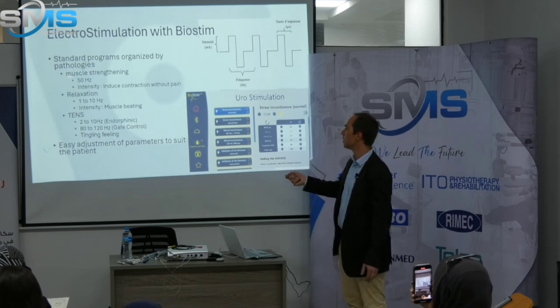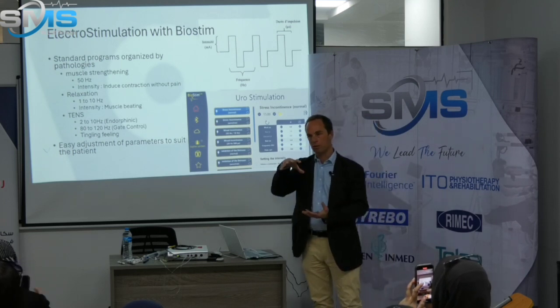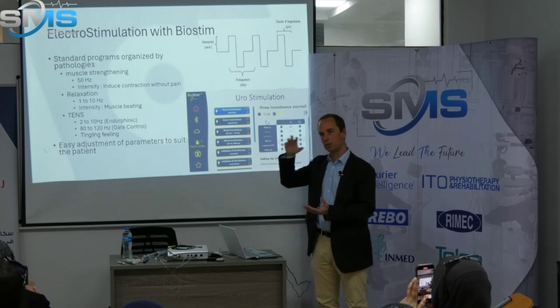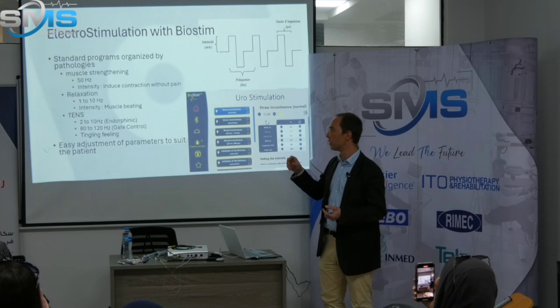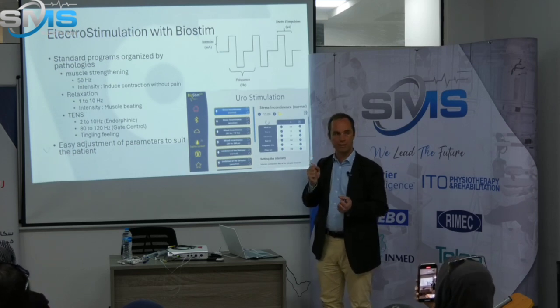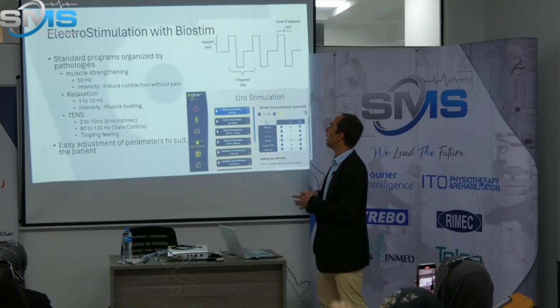That's why we are using it a lot. The second one is relaxation. This can be used for bladder overactivity. With this current, you can relax the bladder. It can also be used for overactive pelvic floor, if you have vaginism or things like that.